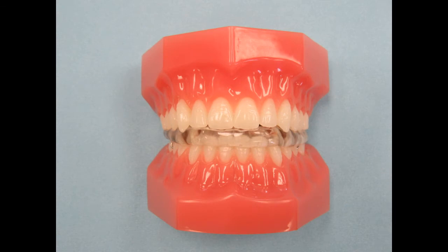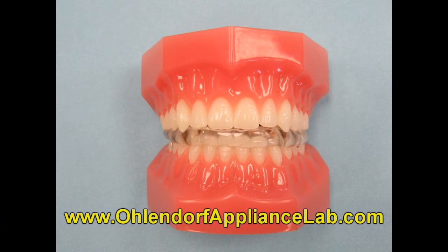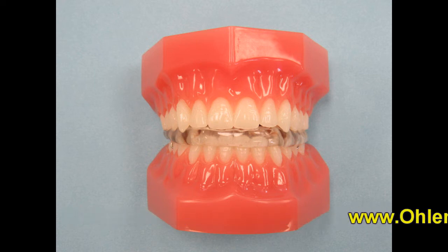It is primarily worn at night. We normally fabricate this night guard with medium indents on the occlusal surface. If you would like deeper, smaller, or no indents at all, please let us know. We can customize the occlusal surface any way you want.